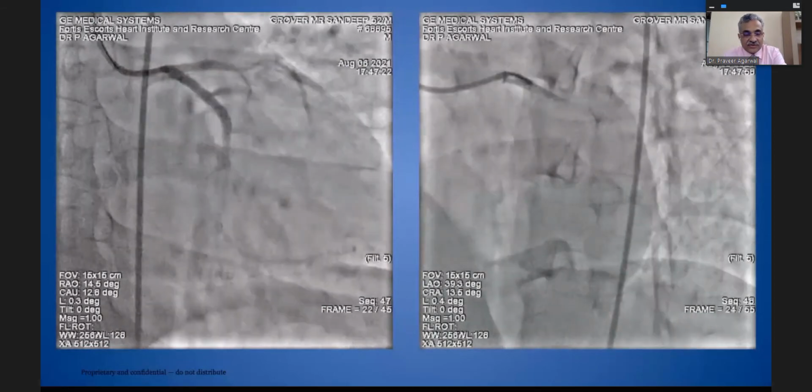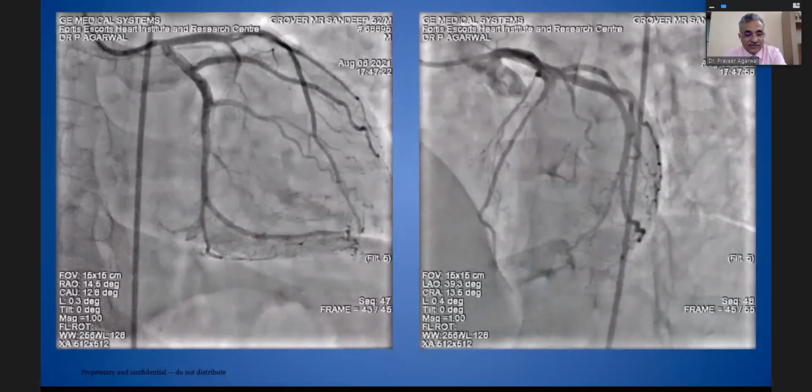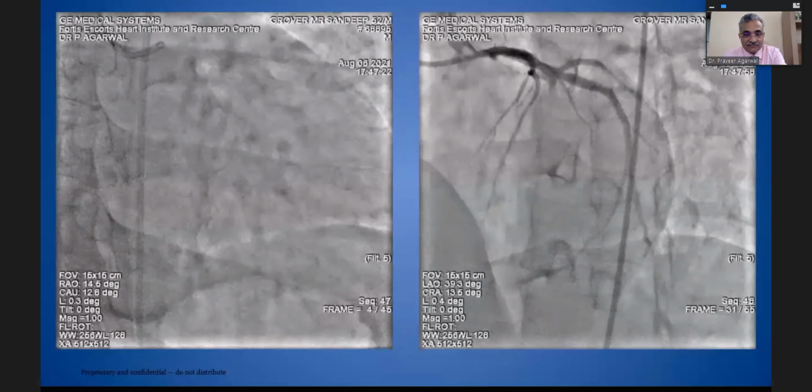This is a different view. It looks nice. So it's a very well deployed stent, and for a scaffold, the high pressures are about 23, 25, not 17 or 18.